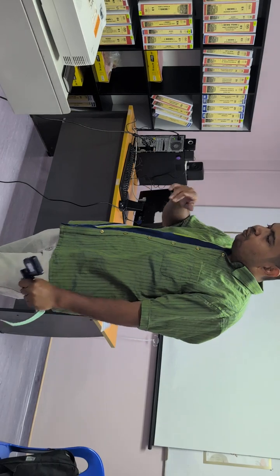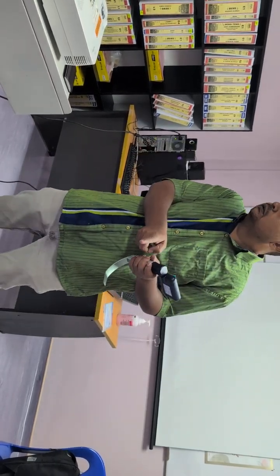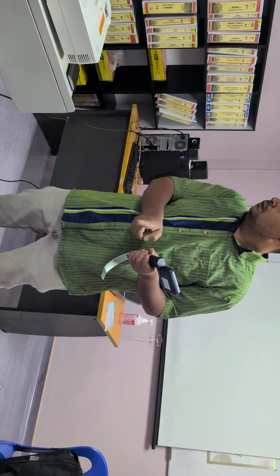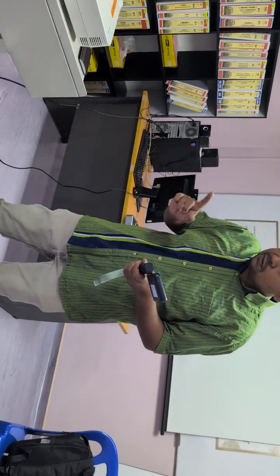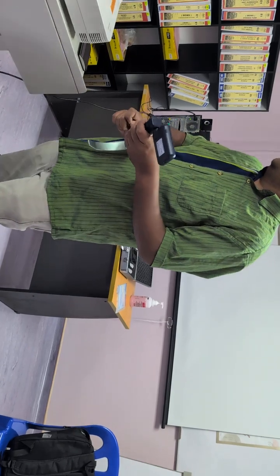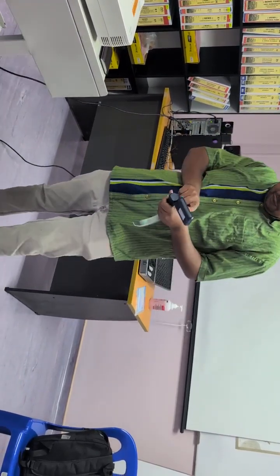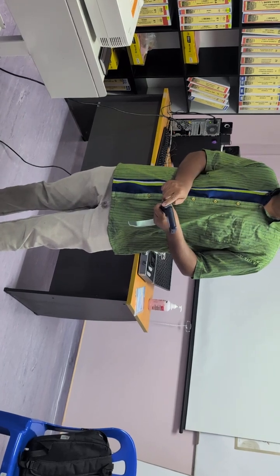Okay. I've also had many questions where they ask me, kenapa benda ni tak kat sini? Okay, the only answer which I can give you is, kalau benda ni dekat sini, how are you going to intubate? Okay? Now, and another question is, kenapa benda ni tak ada kat atas ni?